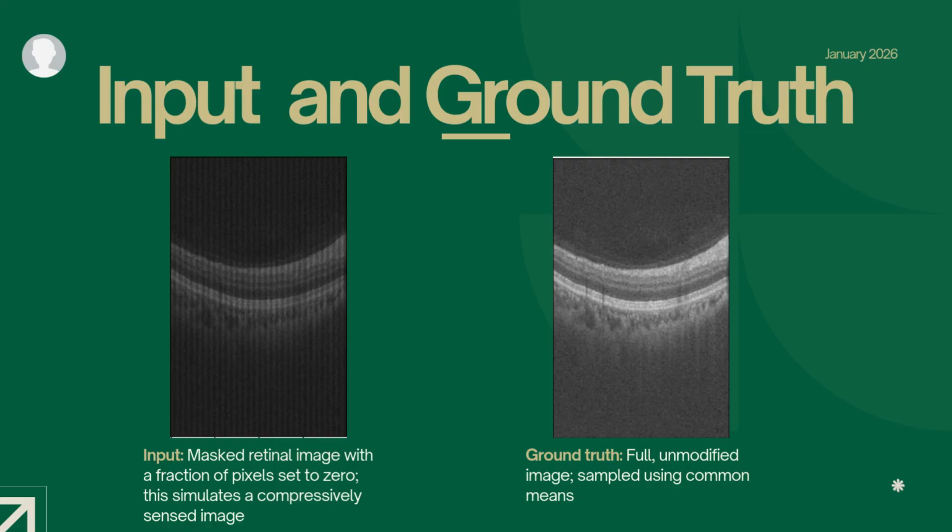It can be seen on the left. A significant amount of information has been set to zero by the mask. The ground truth is a full, unmodified B-scan coming from an optical coherence tomography machine, as can be seen on the right.